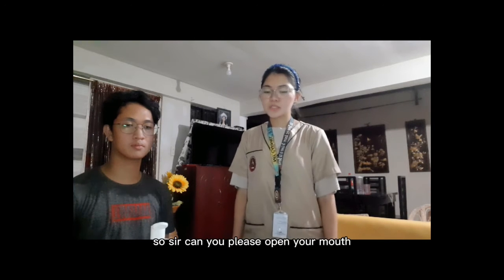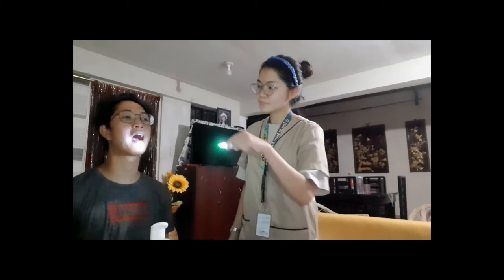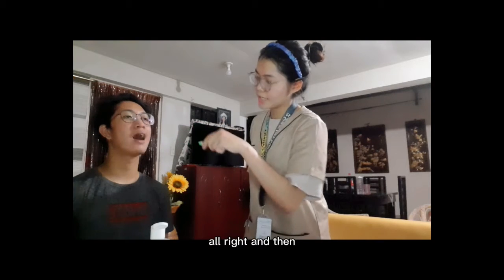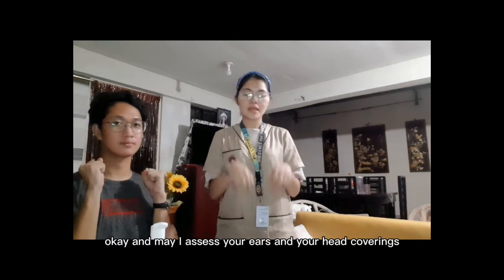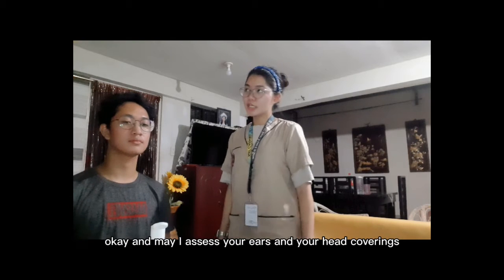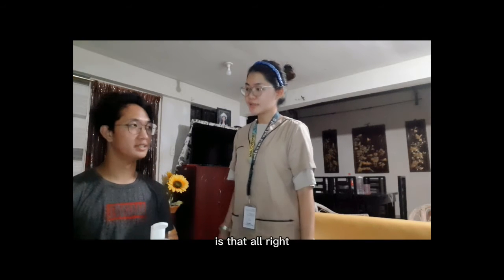So, sir, can you please open your mouth? Alright. And then hold your arms against your body like this. Okay. And may I assess your ears and your head coverings? Is that alright? Yes, ma'am. Alright.